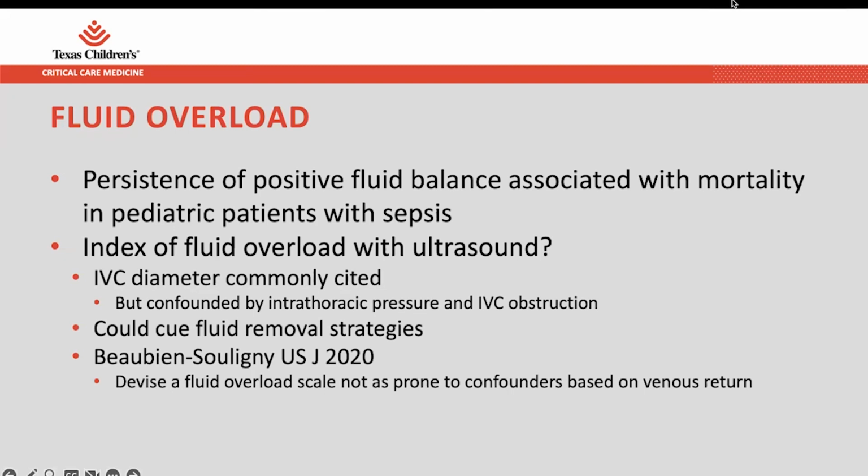So if we can get it down better, could we use an ultrasound index to titrate our removal strategies better, tell us when we need to get dialysis on faster? So Beaubien-Souligny in 2020 published a really interesting paper in the Ultrasound Journal.